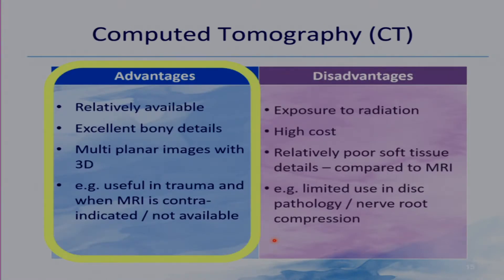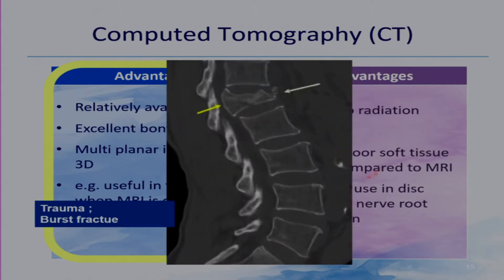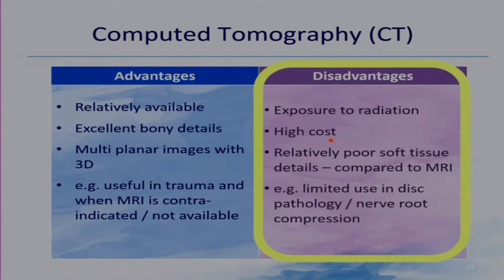Advantages of CT are that it is a relatively available investigation, gives excellent bony details, and images are available in multiple planes with 3D reconstructions. Therefore, it is useful in trauma and when MRI is contraindicated or not available. For example, this CT elegantly shows a burst fracture of the L1 vertebral body. The disadvantages of CT are exposure to radiation, high cost, and relatively poor soft tissue details compared to MRI, limiting its use in disc pathology or nerve root compression.